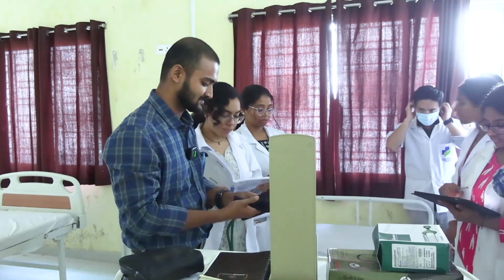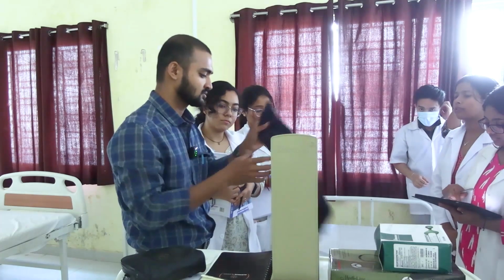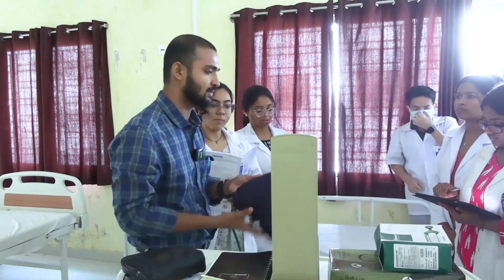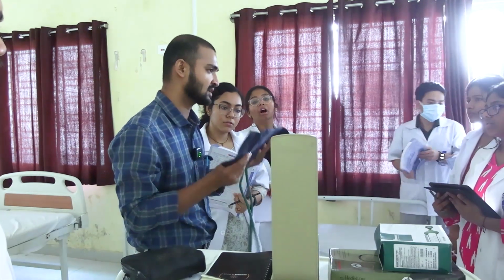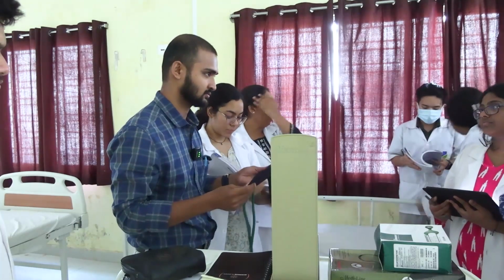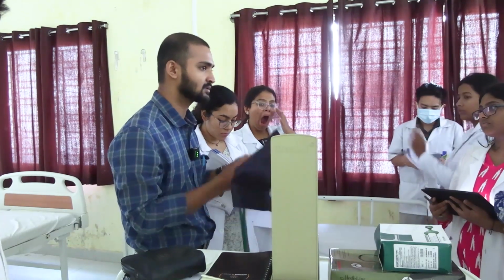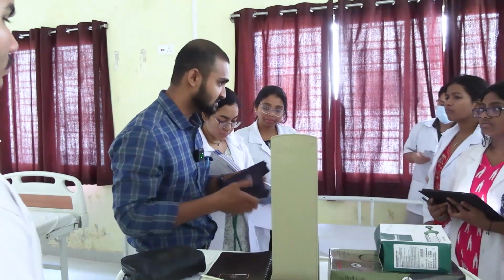What is this? Cuff. So you have to know the parts first. What is the name of this? This is a cuff of non-distensible cloth. This is made up of non-distensible cloth. Means what? Yes, it cannot be stretched.